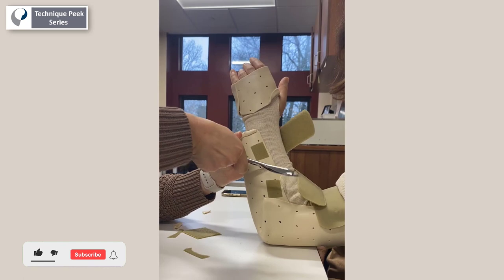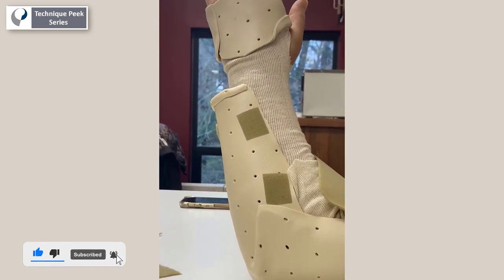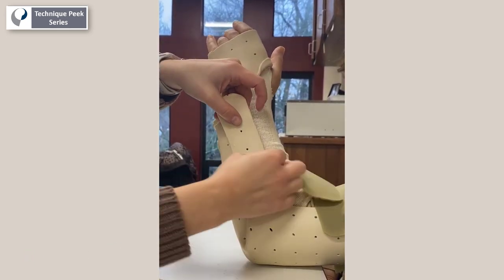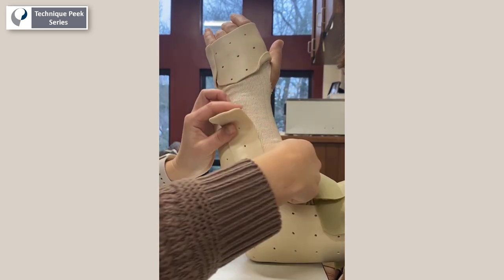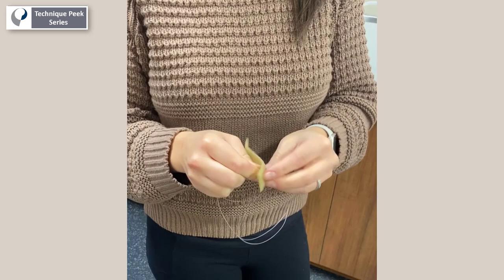In order to affix the wing pieces securely, it's helpful to score both the splint and the wing piece prior to application. When affixing the wing piece, press firmly and smush the edges of the material into the base of the splint. Hold the piece using your index finger to allow it to dry in a horizontal position.